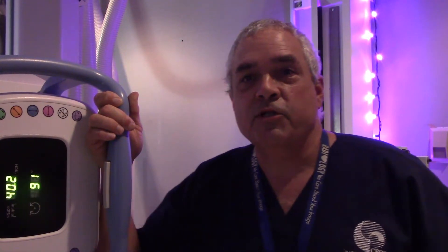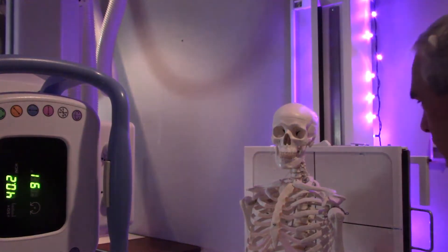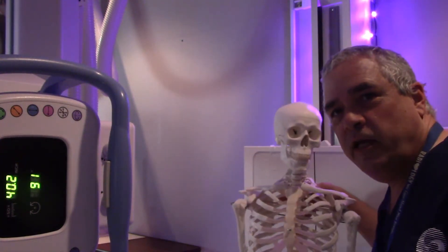Hey there! Good afternoon, radiographers and radiography students. This is X-Ray Ed coming at you once again with some valuable advice. Today we're going to be doing something a little bit different — we're going to be doing some skeleton radiography.